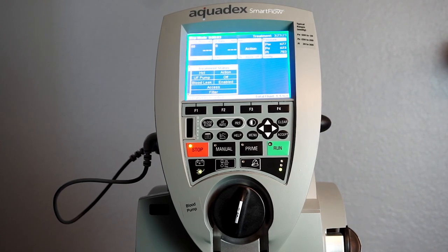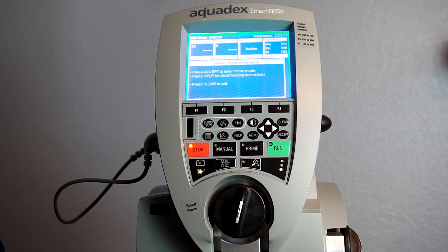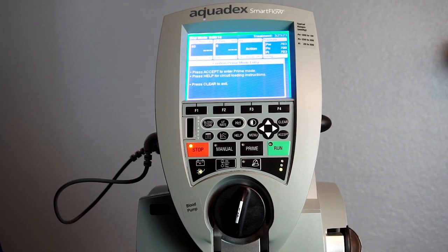In order to load the blood circuit, you'll first want to press the prime button. It prompts you to press accept to enter prime mode, or press help for circuit loading instructions. Press help.